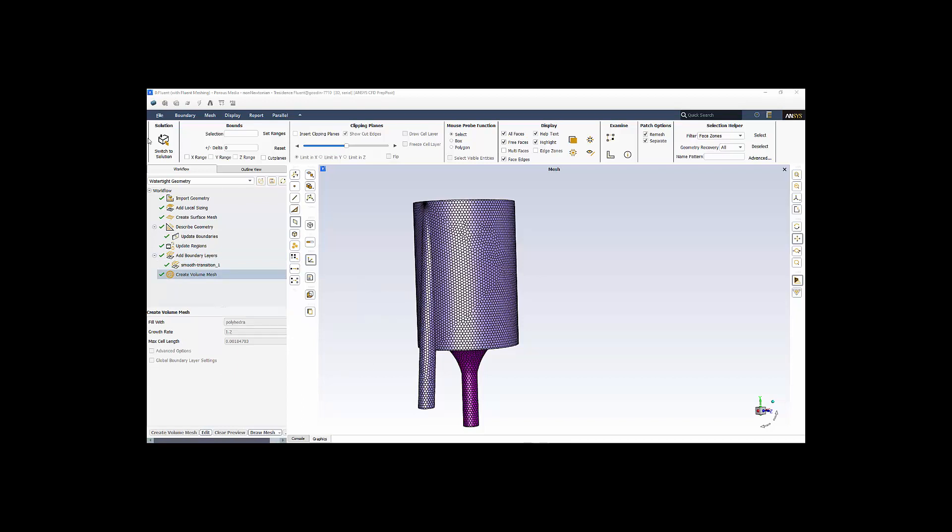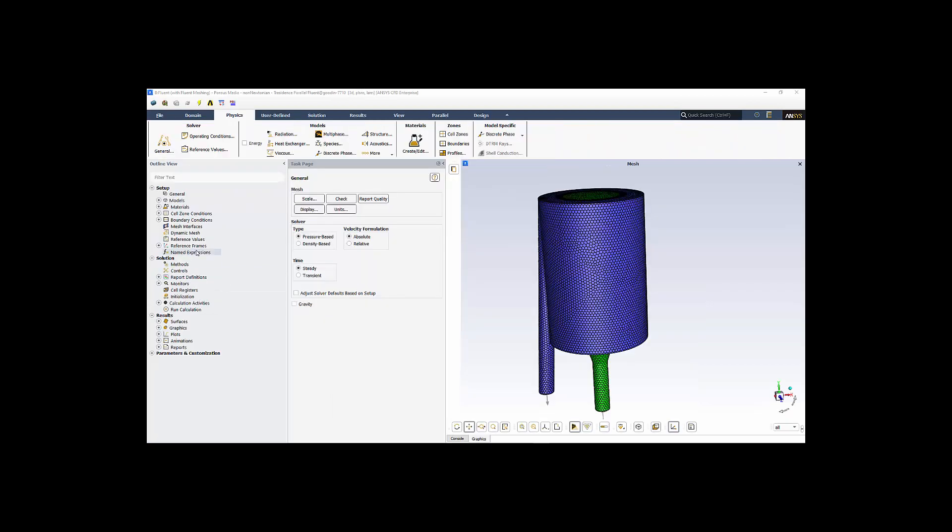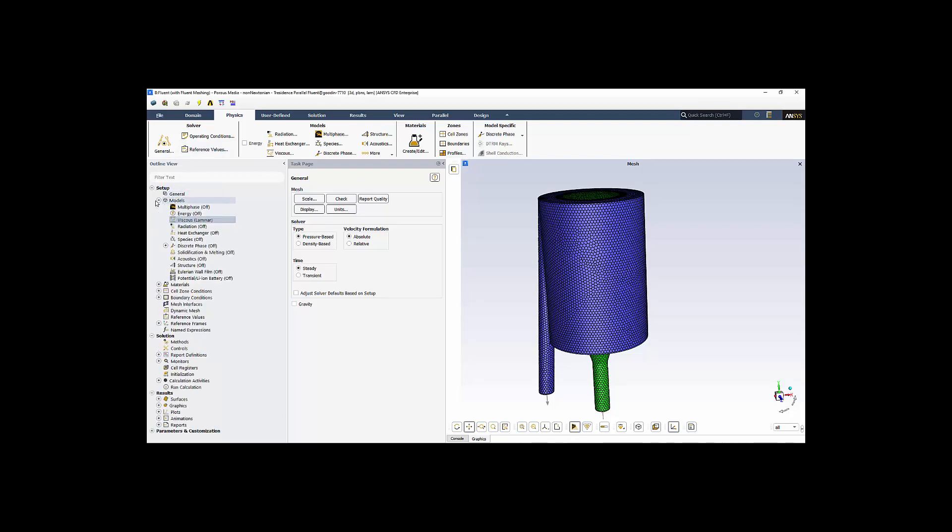So from here, we click on the switch to solution mode. This is Fluent. We have a ribbon across the top, and also you can control your inputs using the outliner tree view on the left.